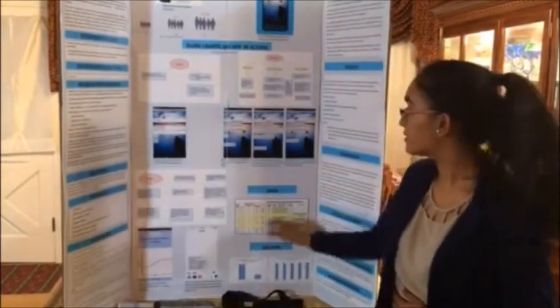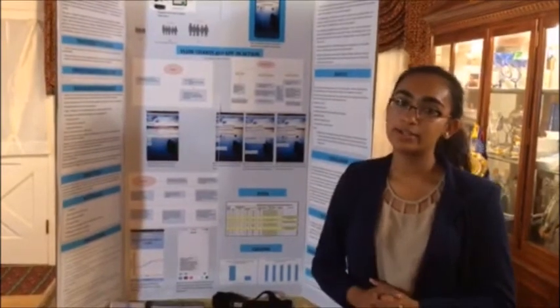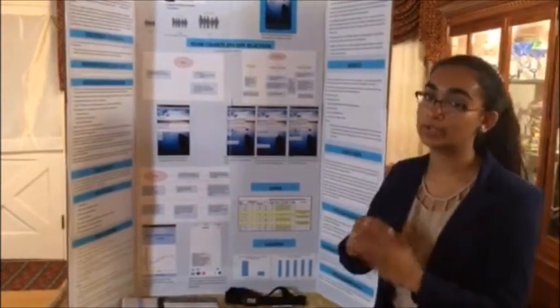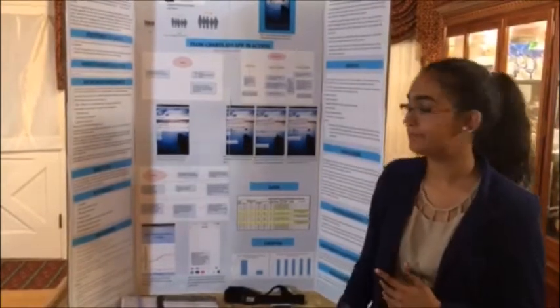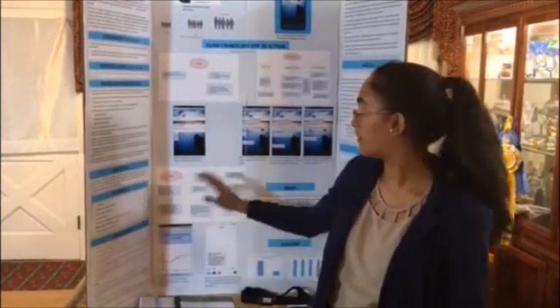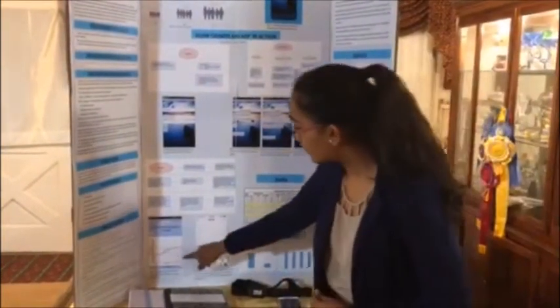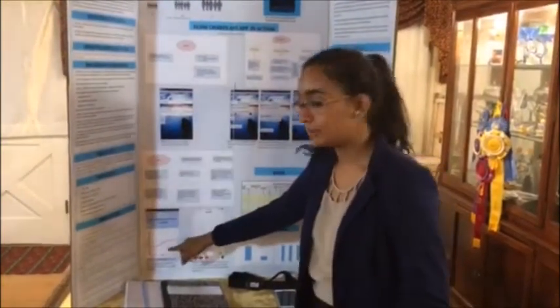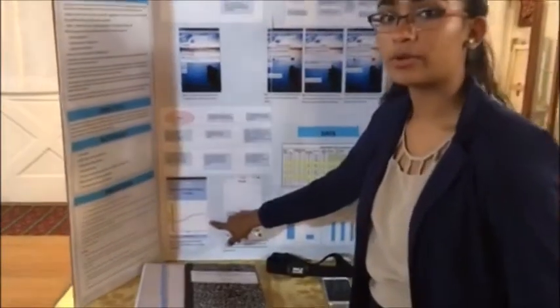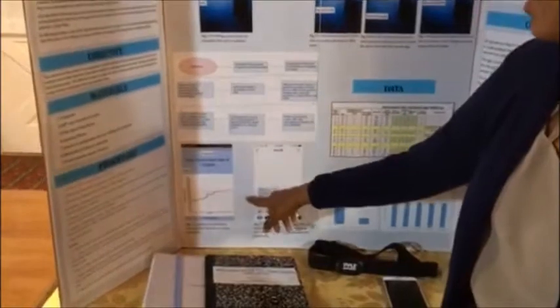Lastly, this customization screen finds your base heart rate, which is used later in the reading screen to compare your current heart rate to, kind of as a threshold to know when you're going too high and when you're going too low. Lastly, here's the reading screen. This is the main screen out of the whole app and is where all the active processing takes place. So, as you can see, this blue line right here is where your normal heart rate is, and this red line is the threshold for when your heart rate gets too high.